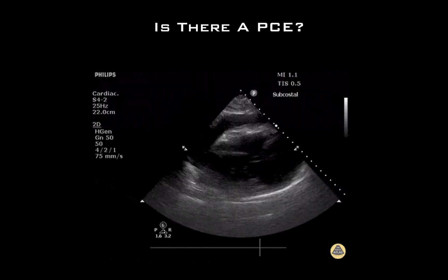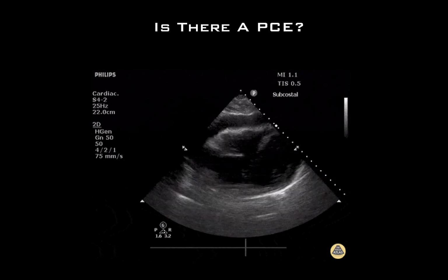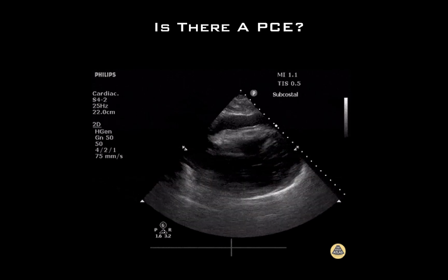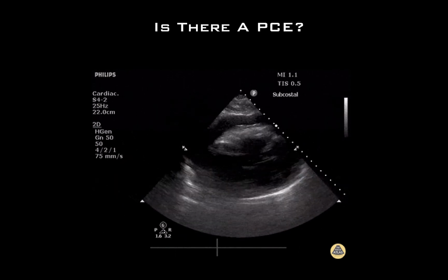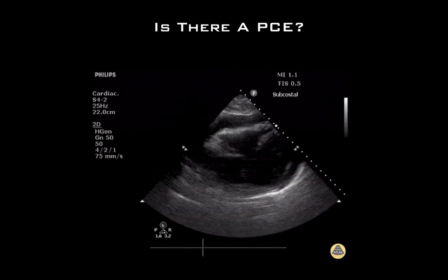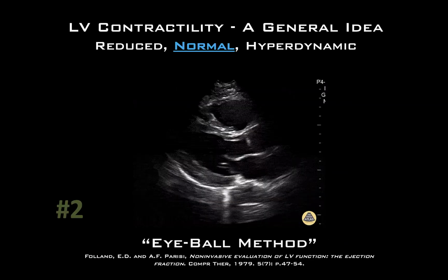Here is an example of a medical patient with an obvious moderate effusion identified on subcostal four-chamber, the view that is the most sensitive for ruling out a pericardial effusion. Clinically, if the patient is sick, the answer to your binary question may imply disposition. Perhaps obtaining a critical care, radiology, or cardiology consultation is warranted based on your findings.